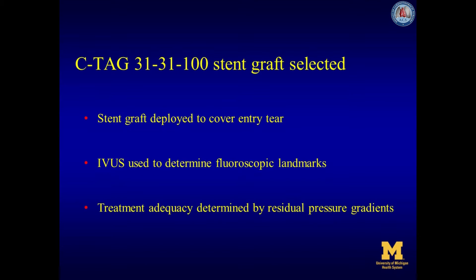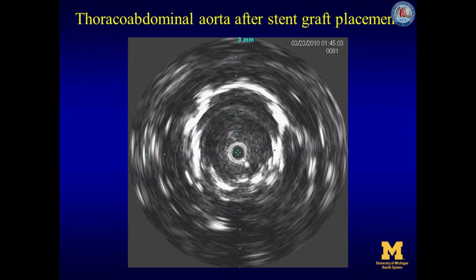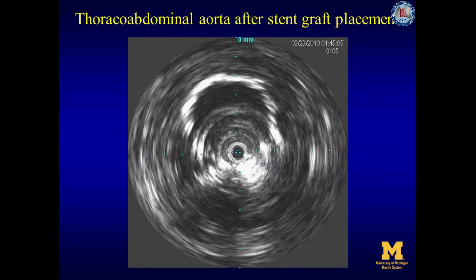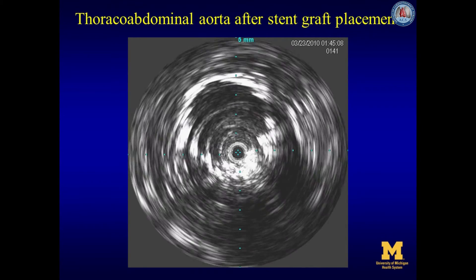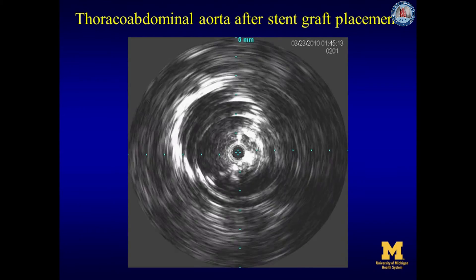A Gore CTAG device of 31 millimeters diameter and 100 millimeters in length is selected. The stent graft is deployed to cover the entry tear while intravascular ultrasound is used to determine fluoroscopic landmarks. After stent graft deployment, residual pressure gradients determine treatment adequacy. IVUS now entering the stent graft shows that it covers only the entry tear and stops short of the visceral segment.